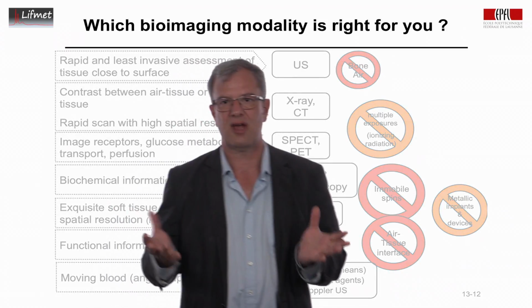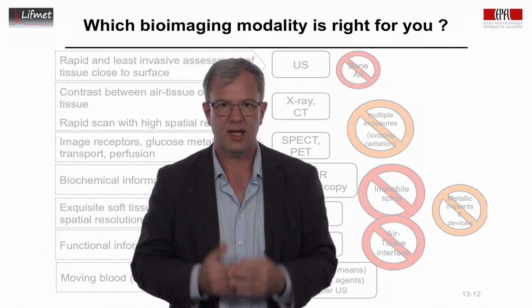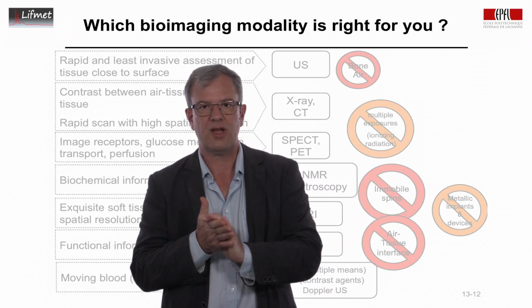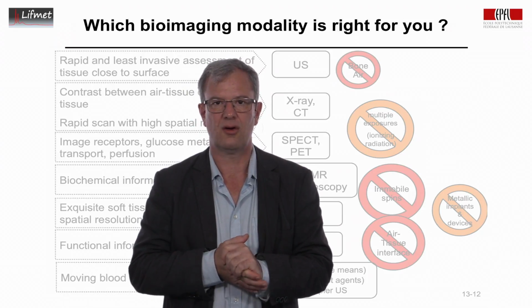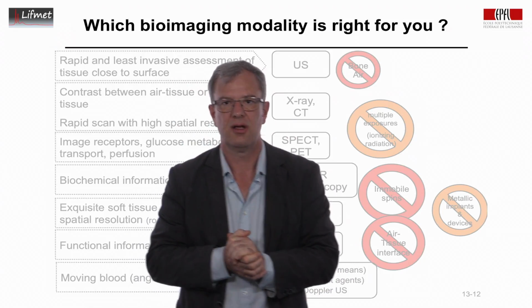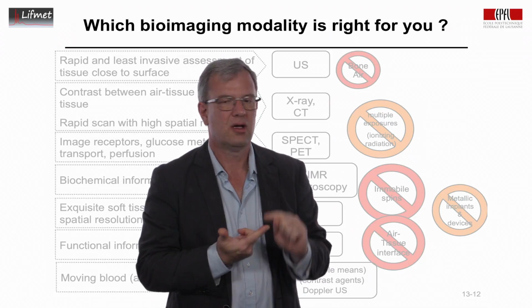So consider as an example, you have a subject that comes to the clinic, is unconscious, probably had a stroke in the brain, and one wants to determine the extent of the stroke, for example, or whether it's indeed a stroke. Typically, one way to detect this is the midline in the brain is displaced in one direction. The person is an elderly person.